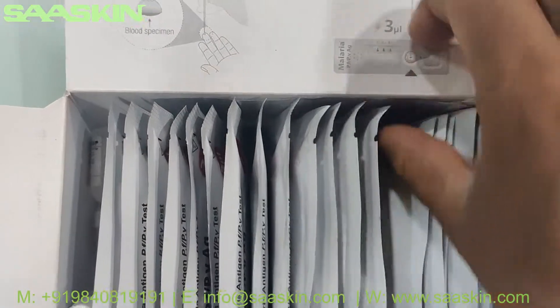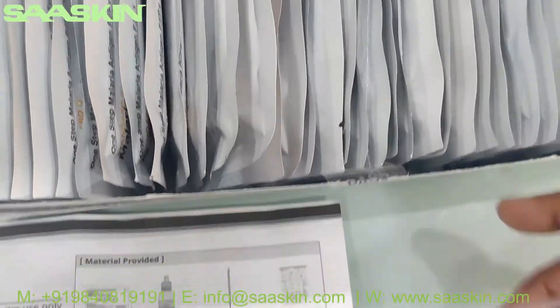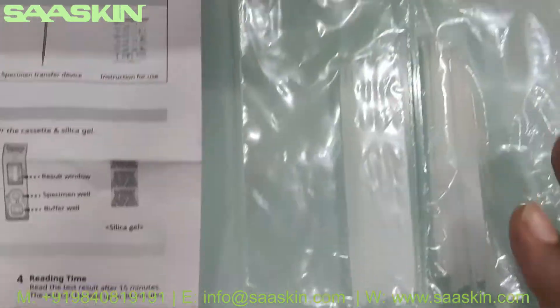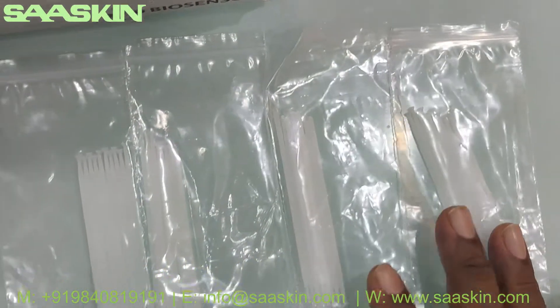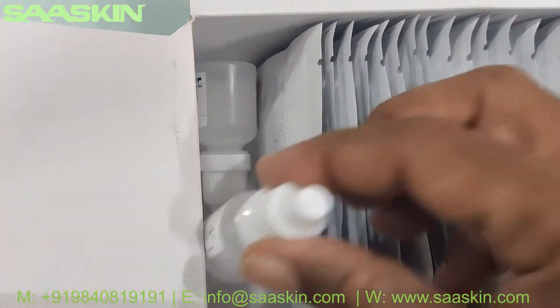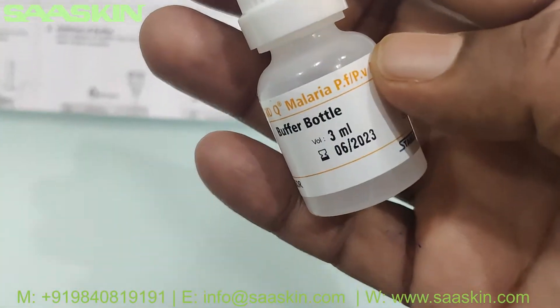We have the specimen transfer devices as well — for the 40 tests, you have 40 devices, packed as 4 packs of 10 each. So totally you have 40 specimen transfer devices. And you also have the extraction buffer bottle here — typically 3ml.